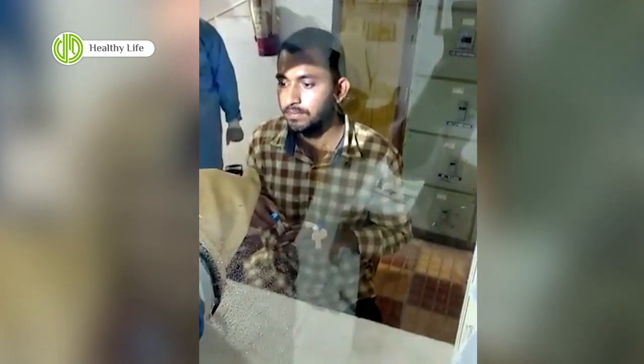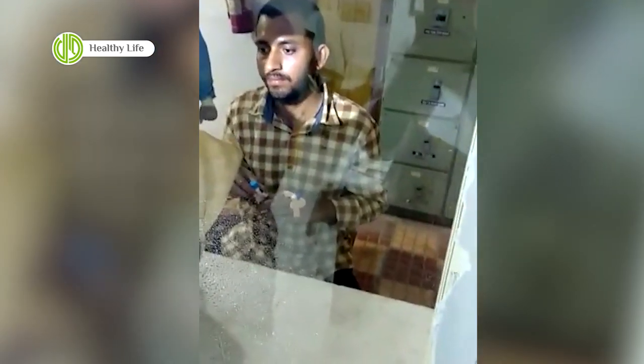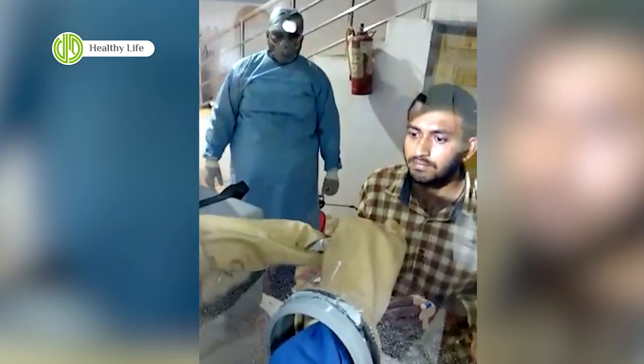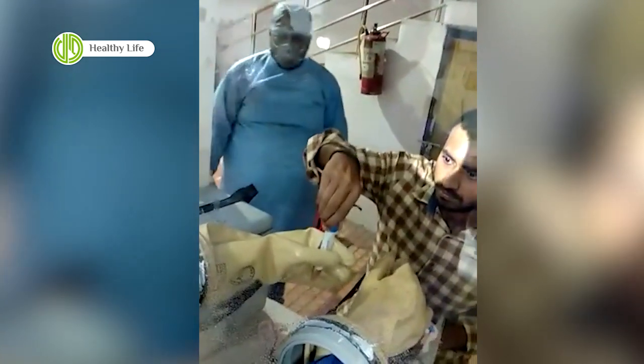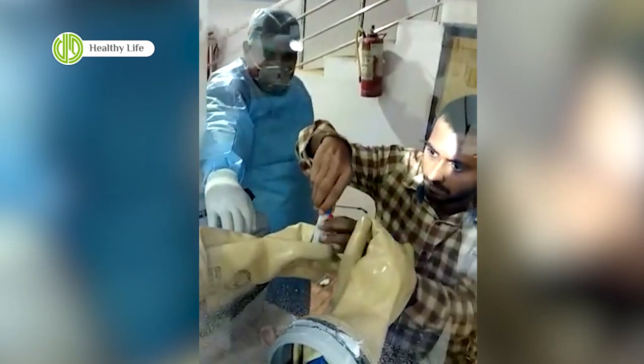He is opening the container, and the swab is introduced into the bottle having the transport medium. It is then being kept into the container having ice packs.